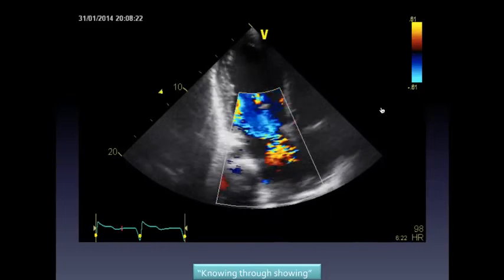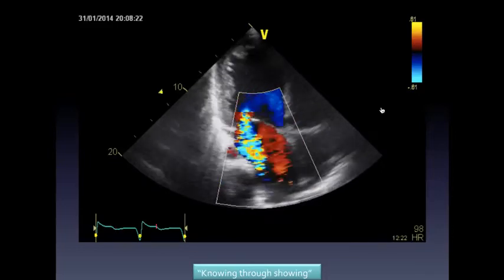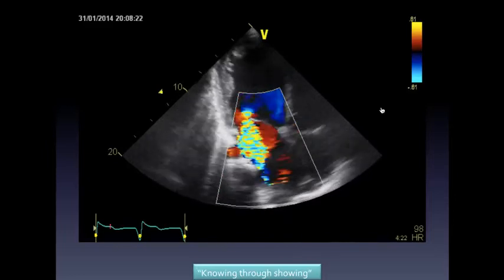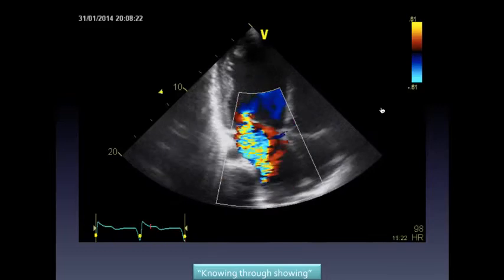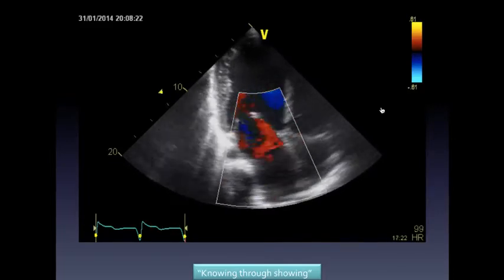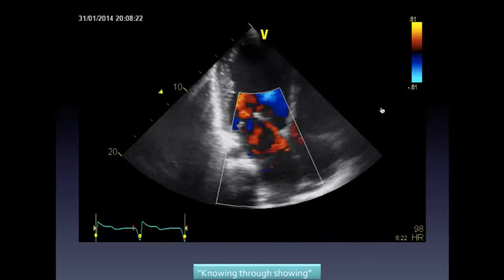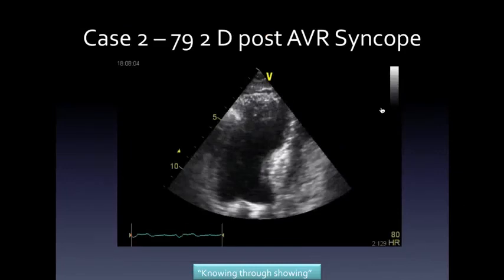Again, the assumptions we make on chronically ill patients: his IVC was very minimally dilated. Okay, so measuring his left atrial pressure, we missed the boat on him because we actually swanned him, and that's a whole other talk. To be honest, the Swan-Ganz catheter, the right heart cath, is profoundly important in the ill patient.